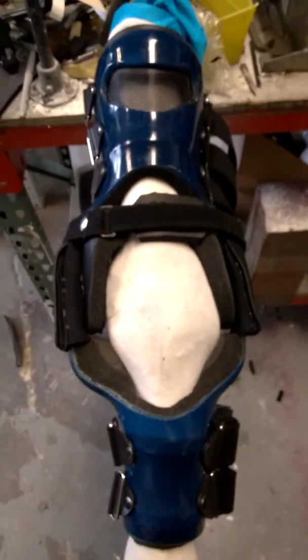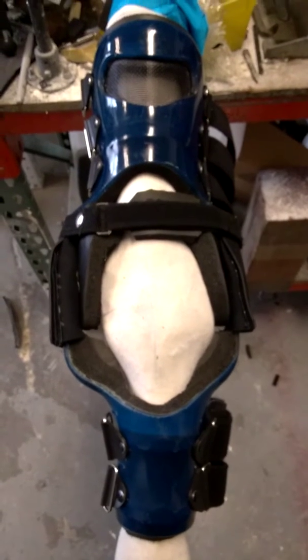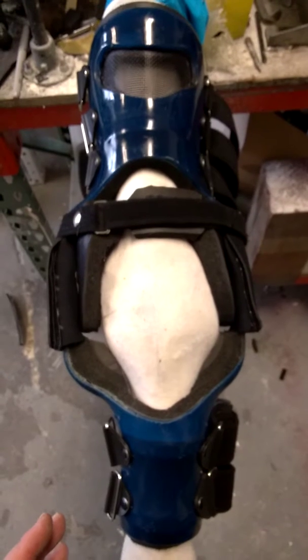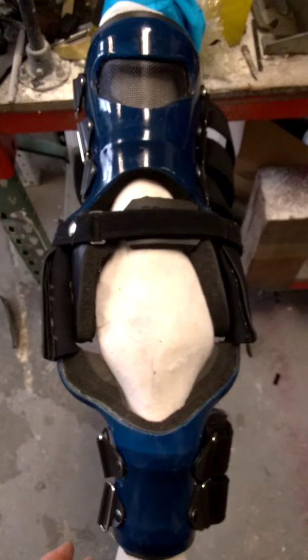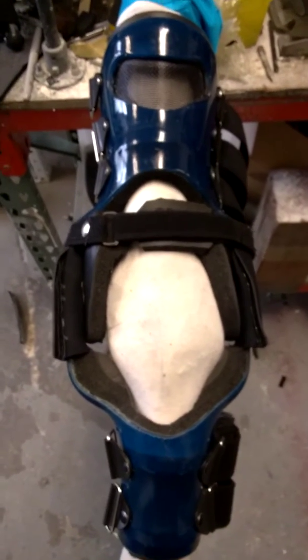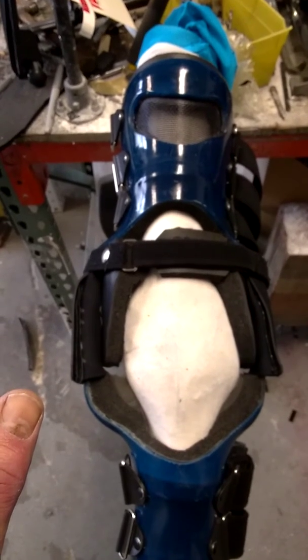This brace is our OA unloader, where we actually take a cast, put our goniometer on it, then talk to the vet and the owner. We put some correction into the actual model, then build the frame to that. So when the brace is done it has correction built into it, and when you put it on the leg, that correction helps unload the compartment where it's bone to bone and the meniscus is gone.